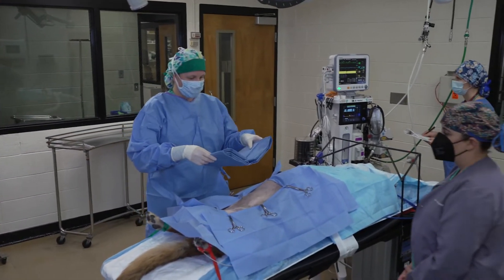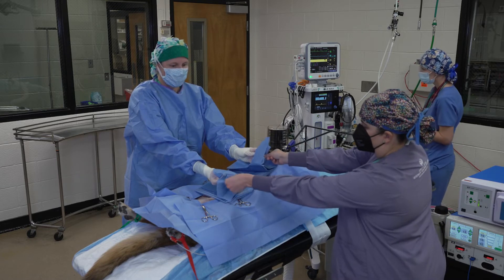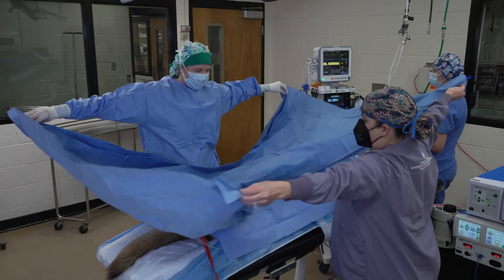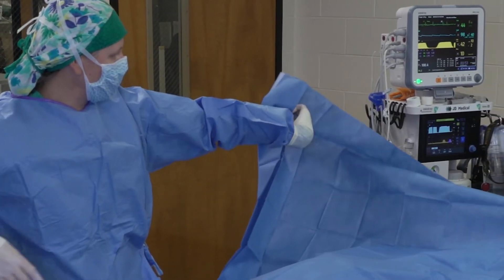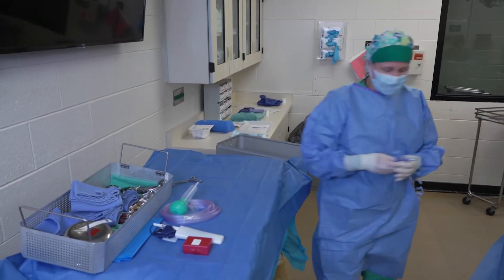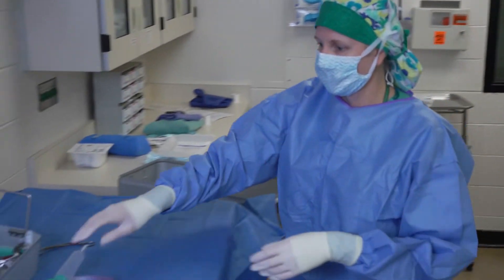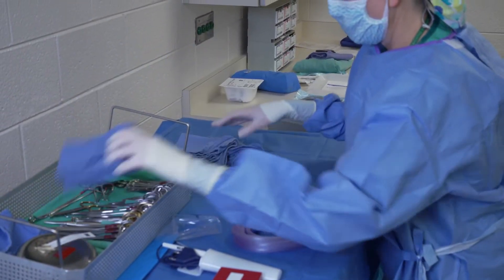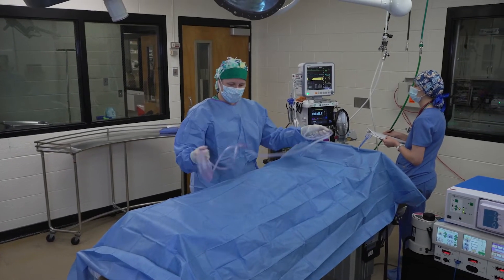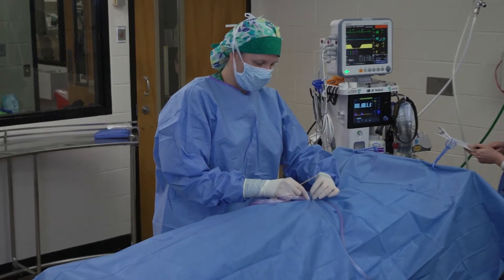Lastly, I'm going to put the patient drape on top. If I have a non-sterile assistant they can help me with this. I'm going to open the patient drape and lay it on top of the patient. I can help my non-sterile assistant by lifting the very edge of the drape so she can grab the underside without contaminating. We're going to pull towards us and away from us as we open up this sterile drape, making sure my hand is protected so I don't contaminate myself on my anesthesia team. I'll use non-penetrating clamps on the outer drape to secure it so it doesn't slide side to side. I'll go ahead and hook up my suction — grasping half of the hose to keep enough for my surgery team, throwing the other half over, then clamping a little pinch of the drape around that tubing.